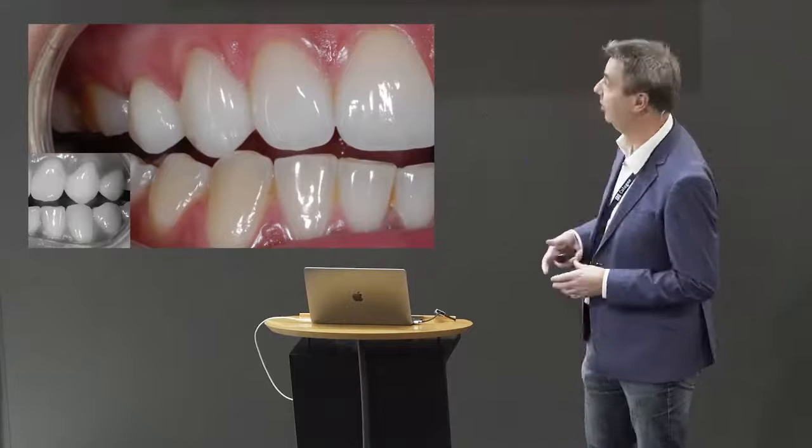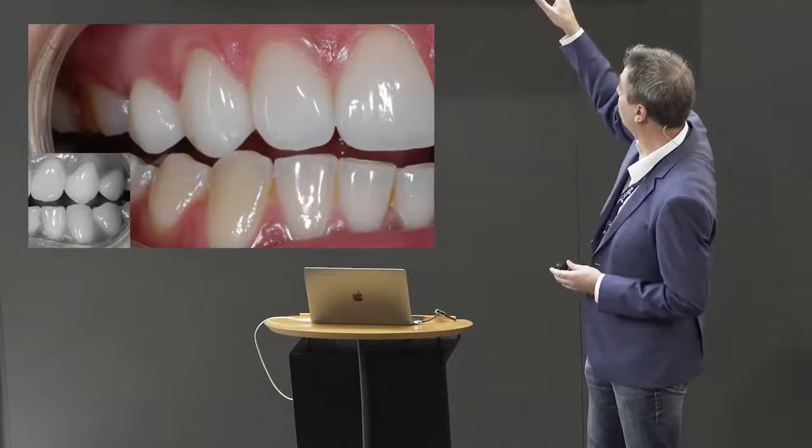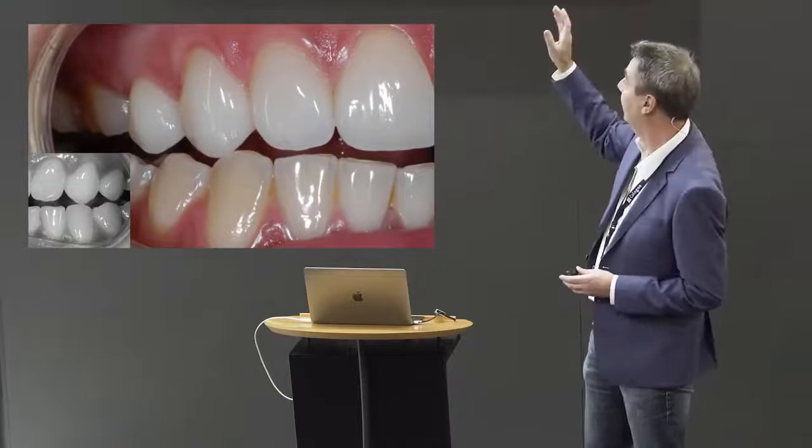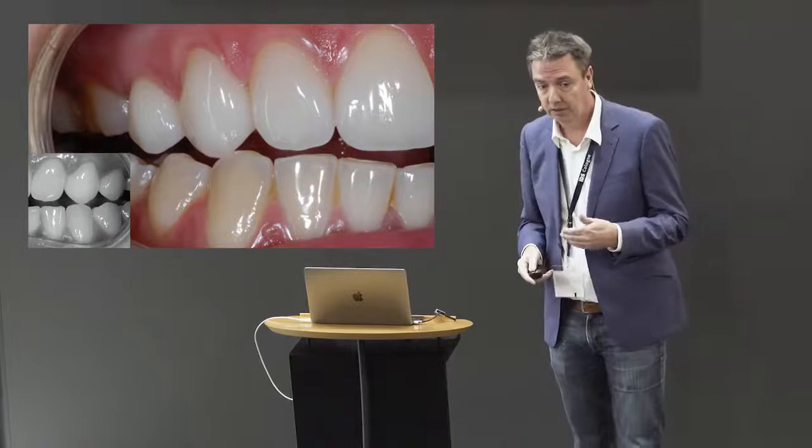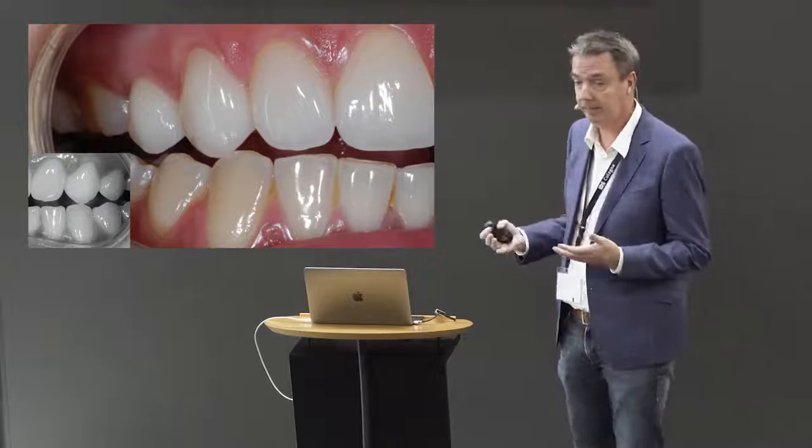This picture shows how we changed it. We changed the canine into a lateral. We changed the first premolar into a canine. We created a nice canine guidance, so we solved the functional problems of the patient. But on the other hand, we also changed the aesthetics.